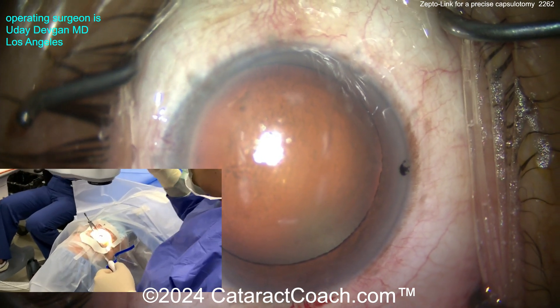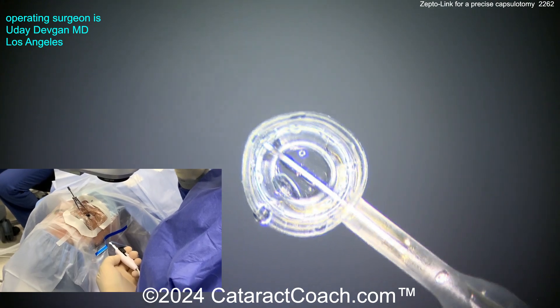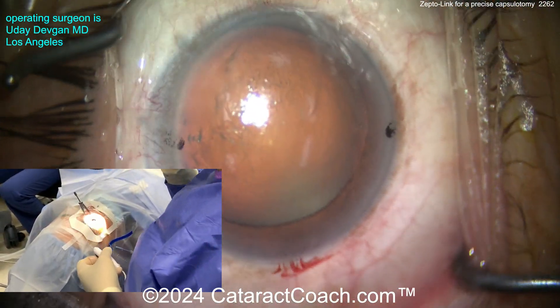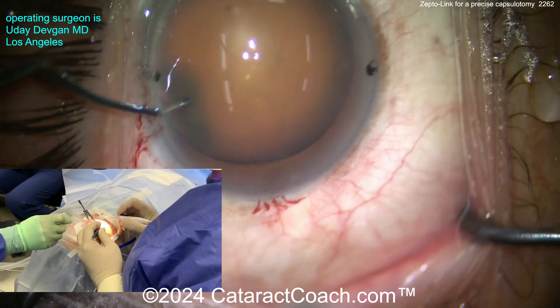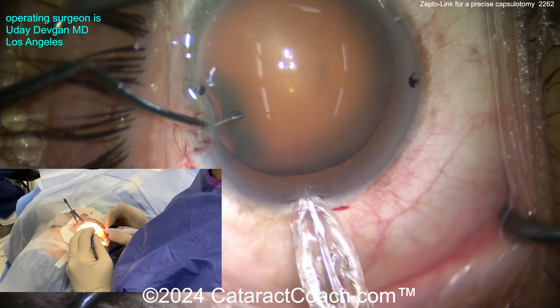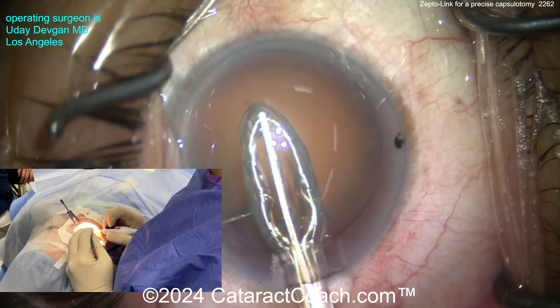I'm examining the device without the microscope first, and now let's bring the scope over. You can see the device — everything looks great. The device is collapsed before it enters the eye. That's why you can create a 5.2 millimeter capsulotomy — or whatever size you want — through this tiny incision. There it is, going through a 2.2 millimeter incision, set up in the eye.